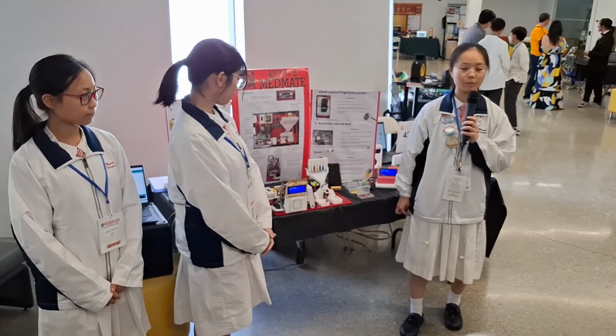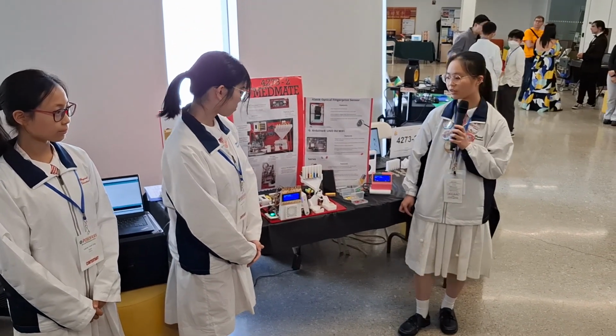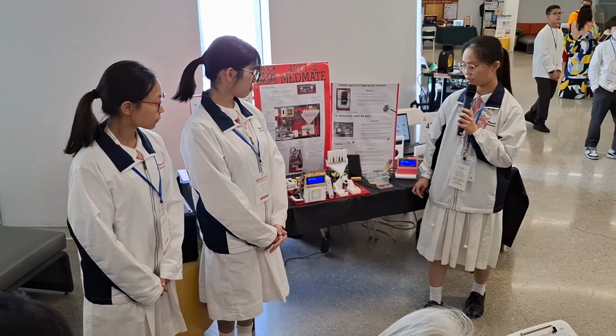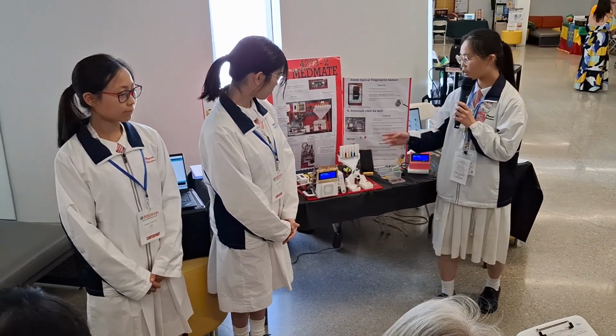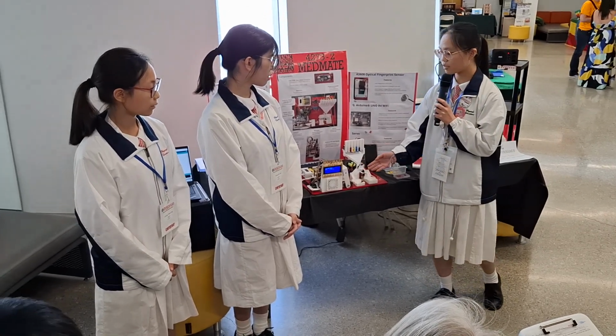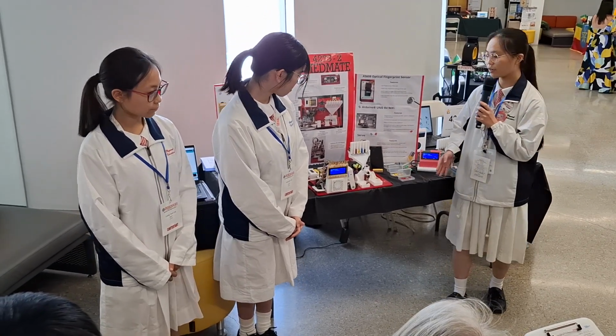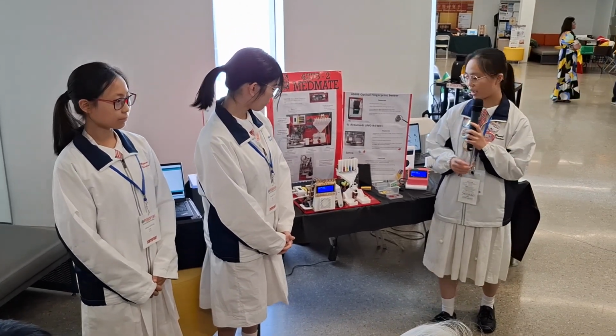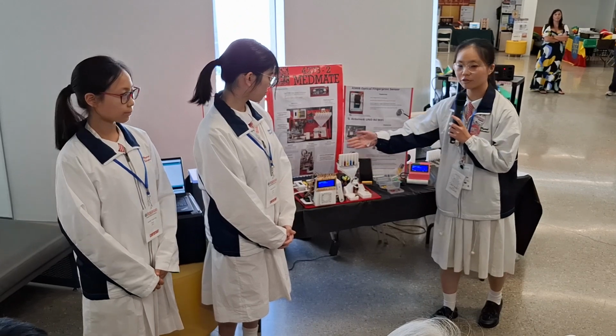Finally, the Mega board will perform the third and last function, cutting the pills. It will begin after the pill distribution. The pill dropped in the white 3D printed component will be chopped into two halves according to the patient's prescription. It will be carried out by a servo that is controlled by the Mega board.